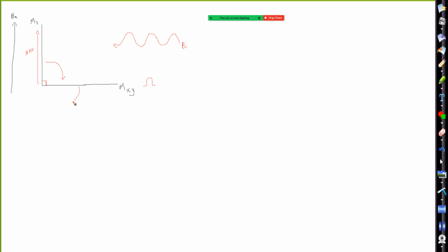And if we think about it three-dimensionally, it's going to oscillate or rotate around this transverse plane. A rotating magnetic field that comes across a stationary coil will induce a voltage in that coil. So we'll get some kind of potential difference. A voltage will be applied, and then that will ultimately be carried to our computer system, right?